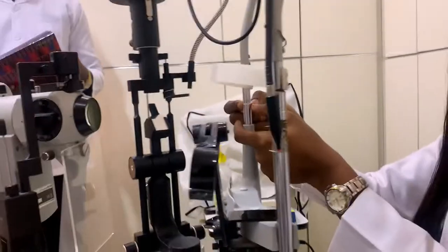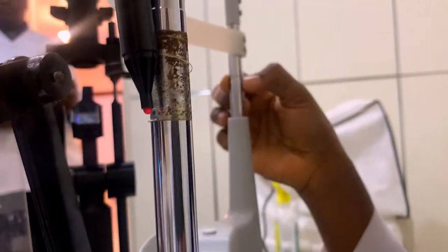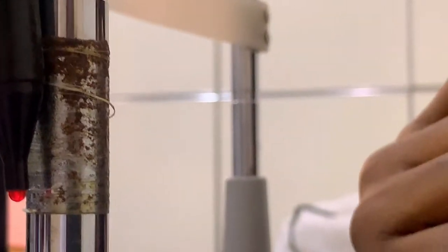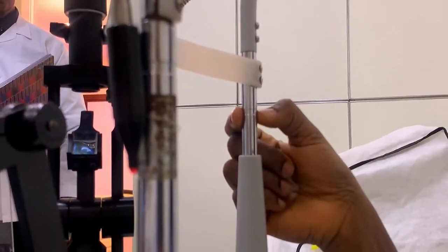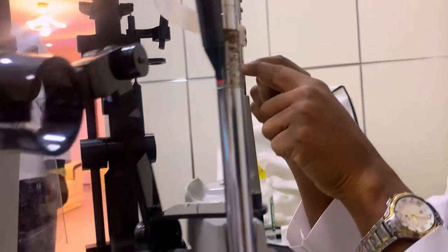After the forehead rest, next is the cantus alignment marker. This is what is called the cantus alignment marker. This cantus alignment marker is what helps the clinician to align the patient's temporal cantus during patient setting or patient preparation. It must align with this cantus here. After the cantus marker, this is the lateral cantus alignment marker.